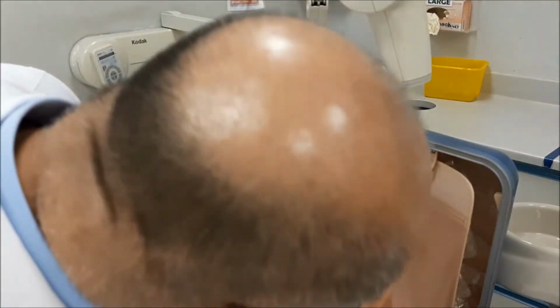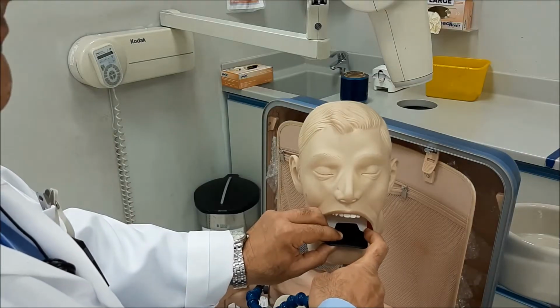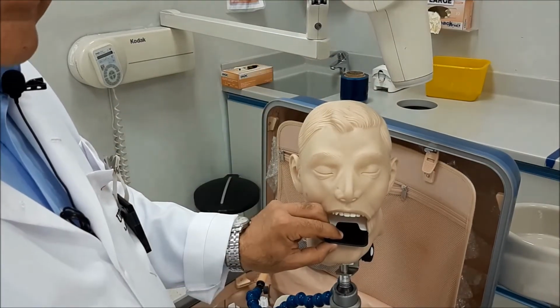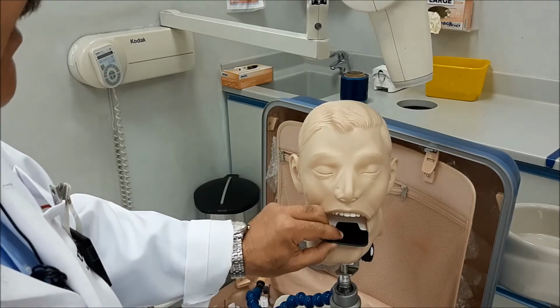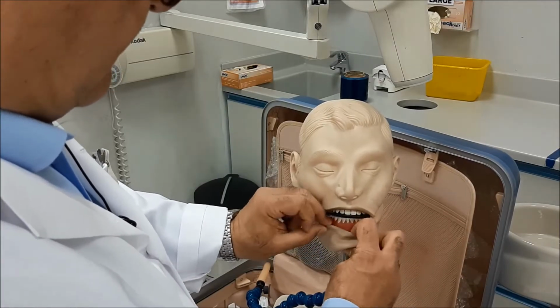You better look inside the oral cavity to see how much the film can be extended. One good sign of knowing when to stop is when the patient starts to blink, it means that he's being irritated from that film. So at this time, this is the time to stop introducing the film inside the oral cavity. Then you ask your patient to bite, okay?